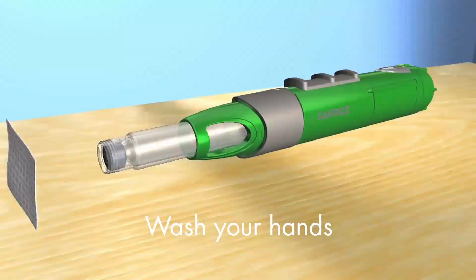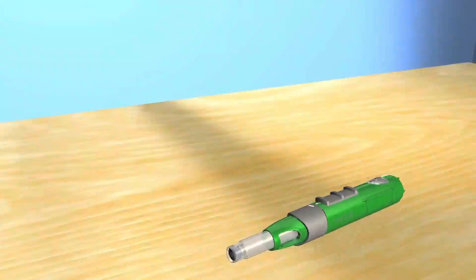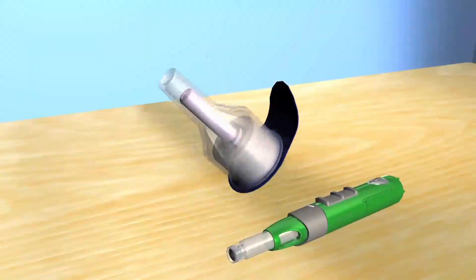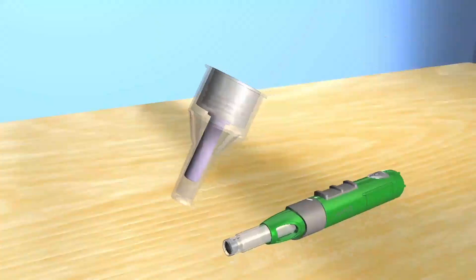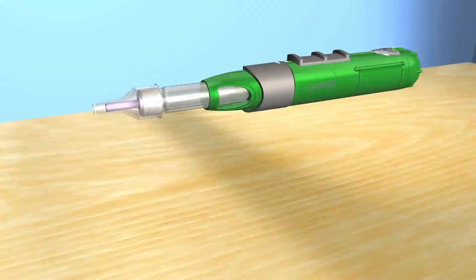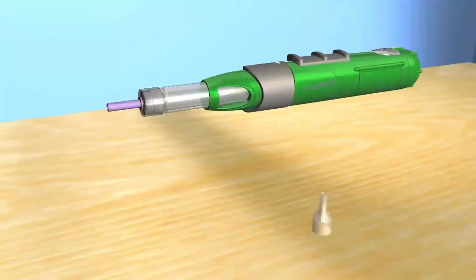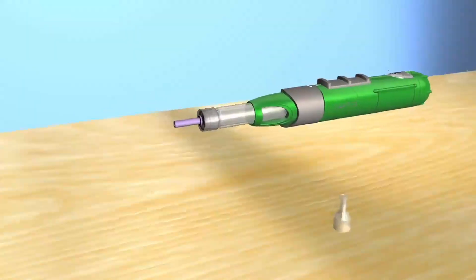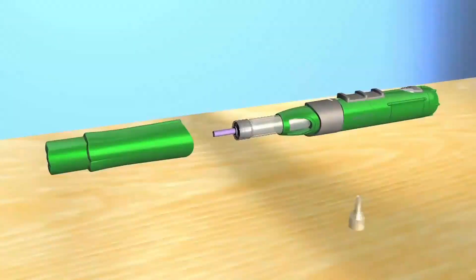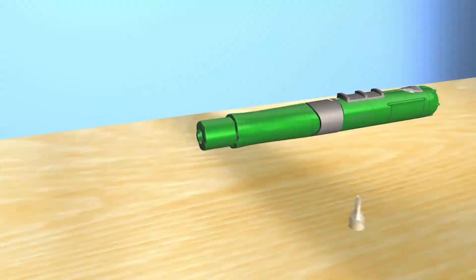Pick up a disinfectant swab and clean the end of the cartridge. Put the SurePal down, then pick up a needle and peel the cover off. Pick your SurePal up and hold it by the locking ring, then screw the needle onto your SurePal. Take the outer cover off the needle and save it for later — do not take the inner cover off yet. Now decide if you want to use the optional needle hider. You don't have to use it, but if you do, attach it now. This video shows you how to inject using the needle hider.